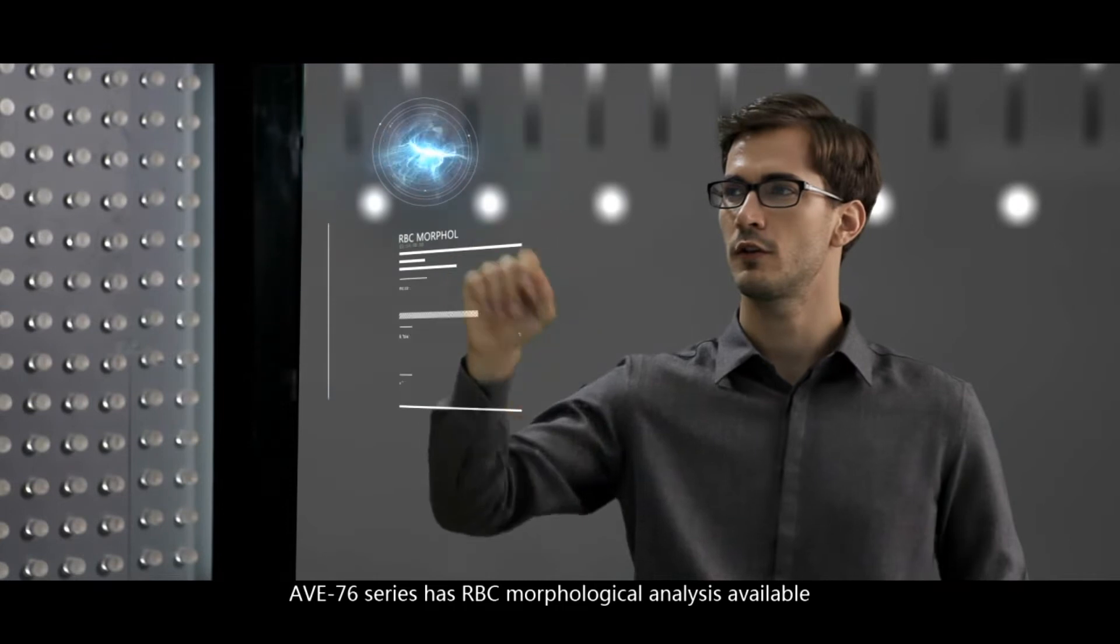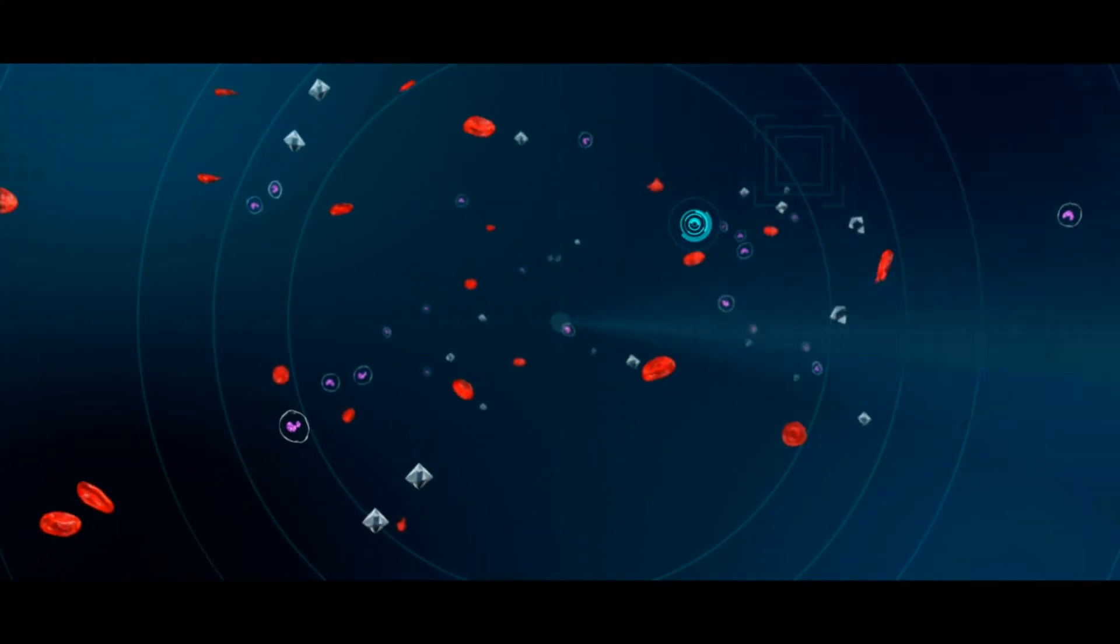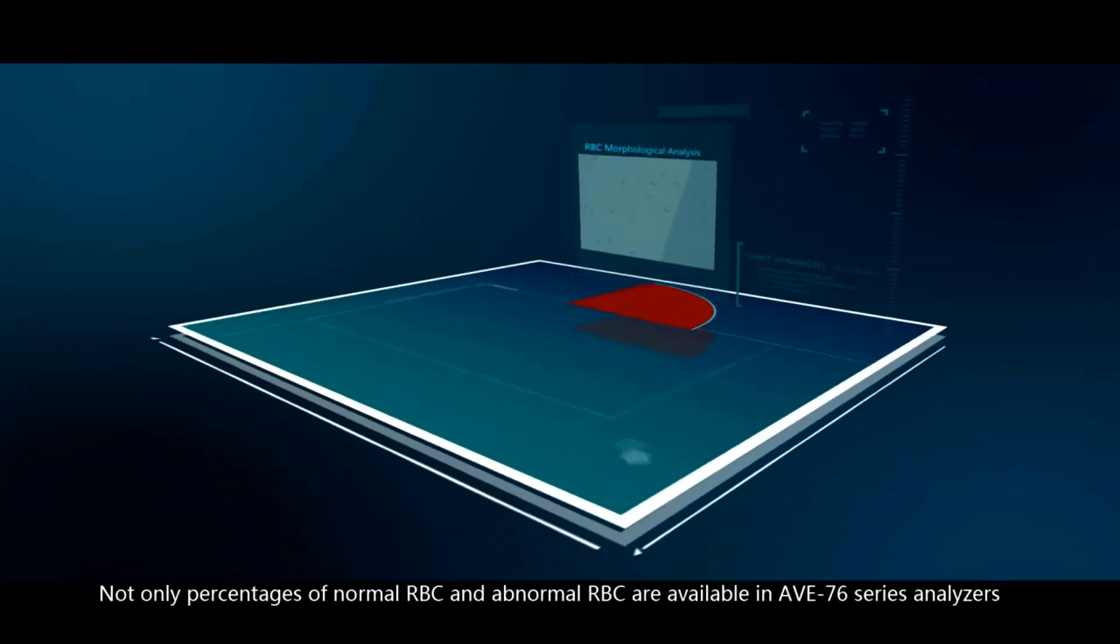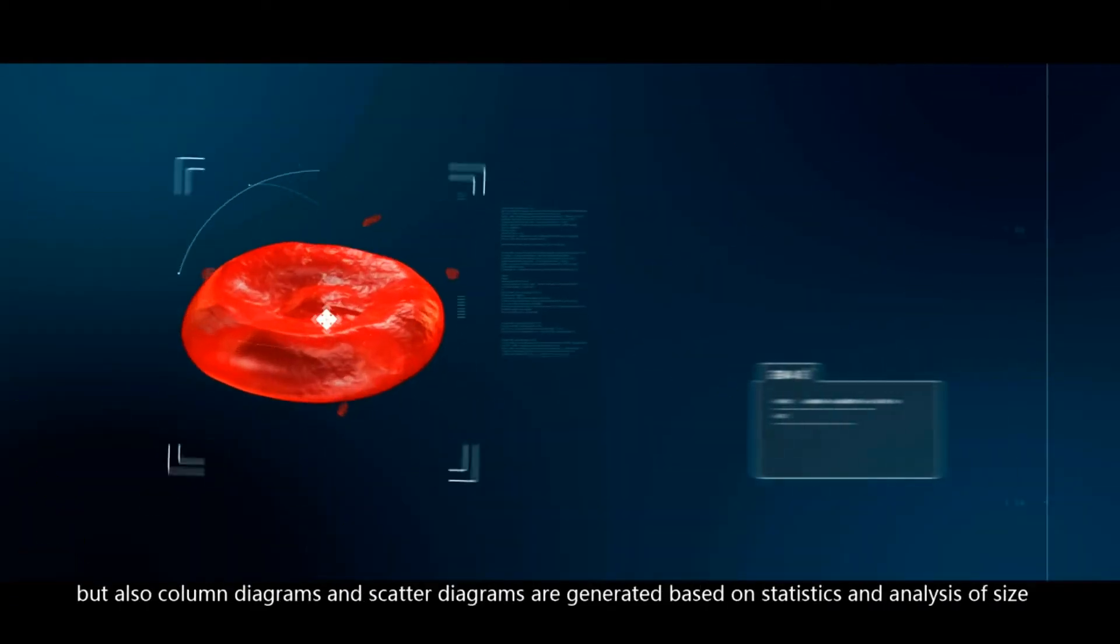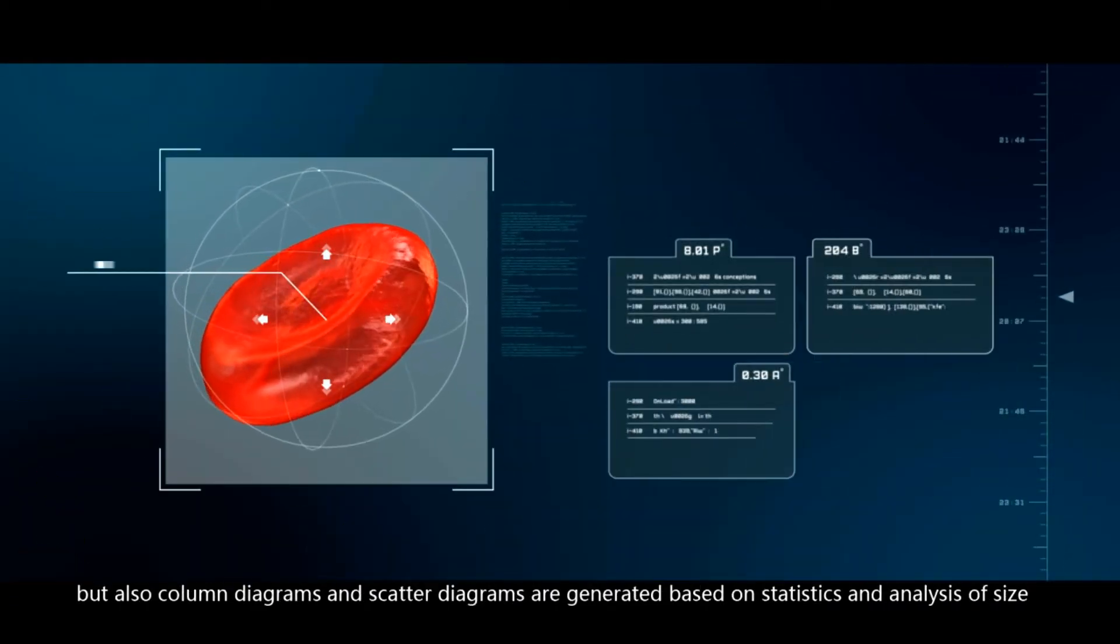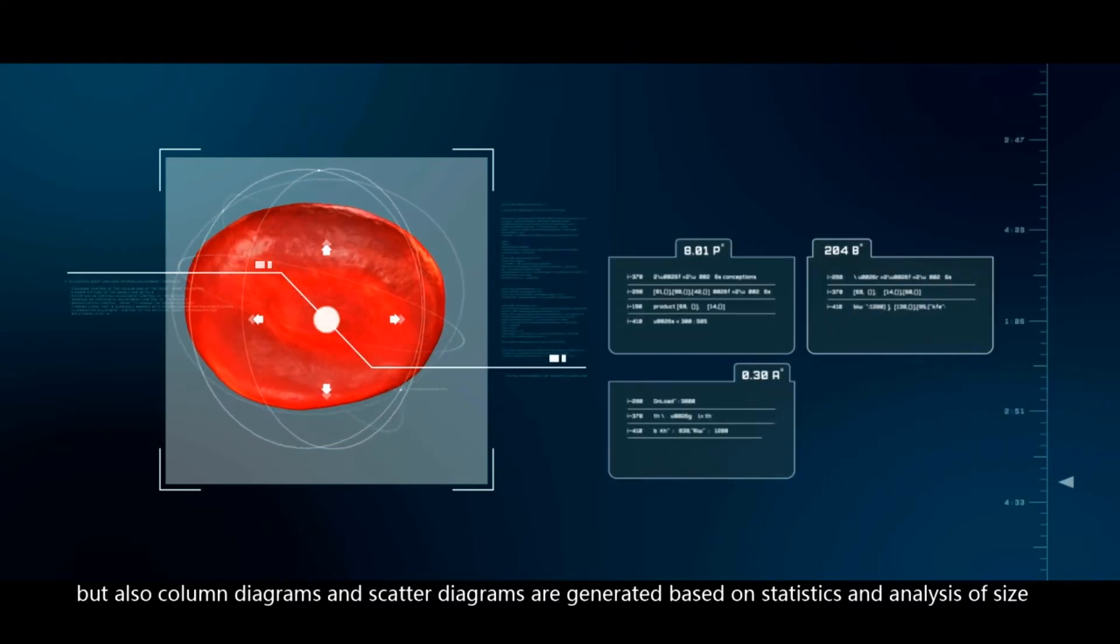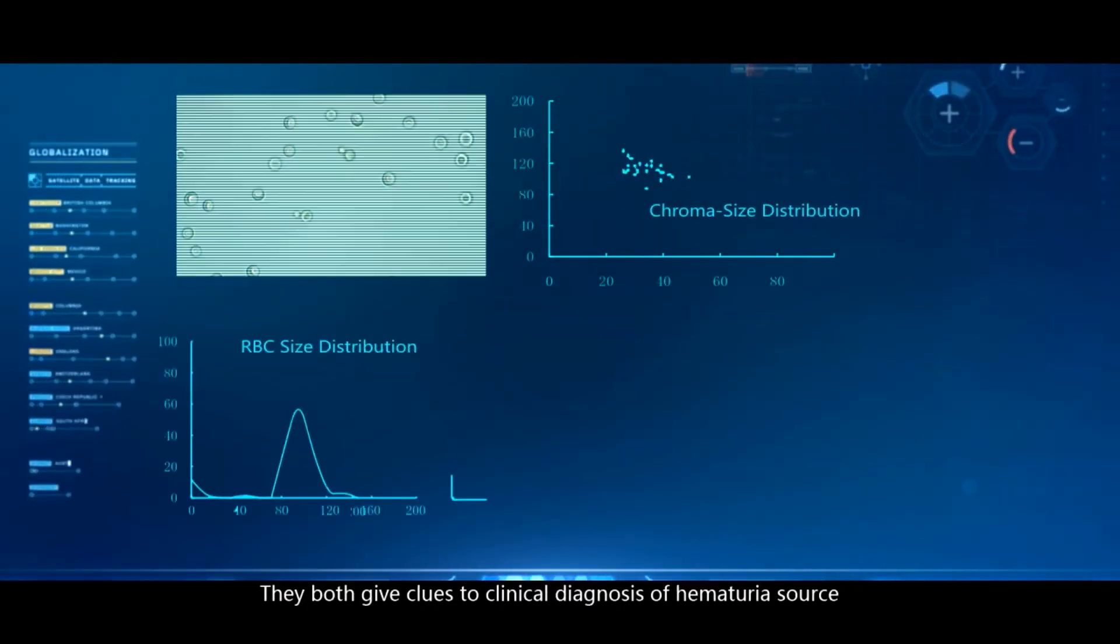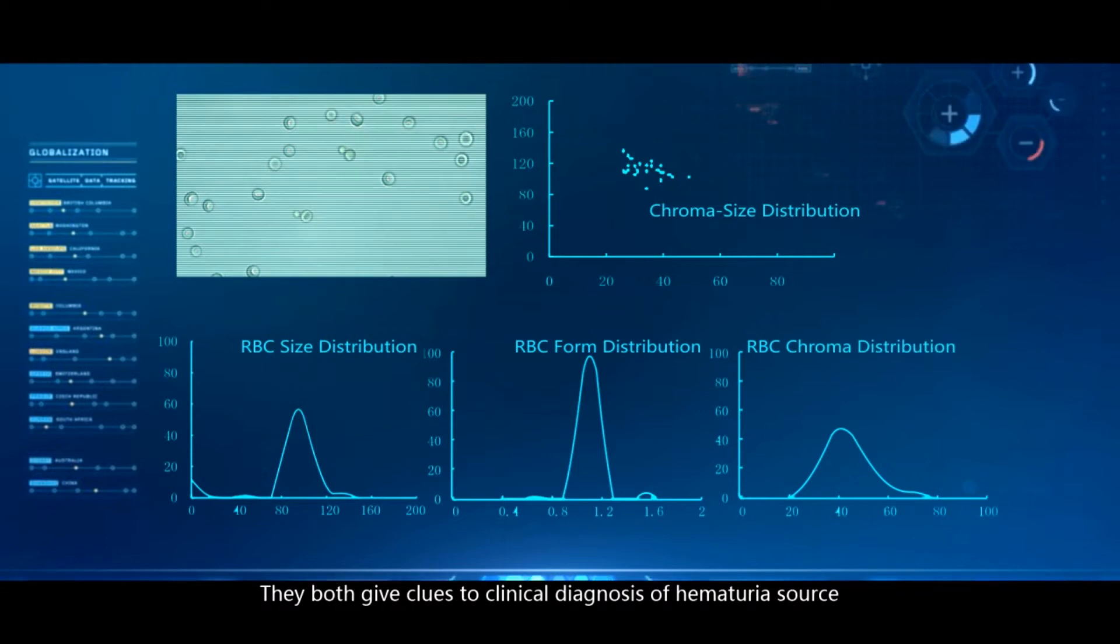AVE-76 series has RBC morphological analysis available. Not only percentages of normal RBC and abnormal RBC are available in AVE-76 series analyzers, but also column diagrams and scatter diagrams are generated based on statistics and analysis of size, form, chroma, and uniformity of RBC. They both give clues to clinical diagnosis of hematuria source.